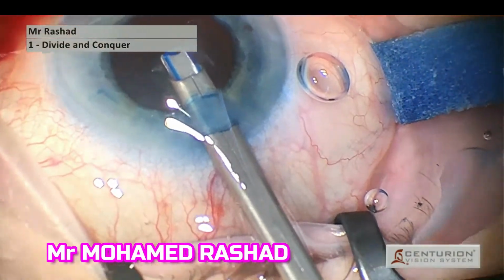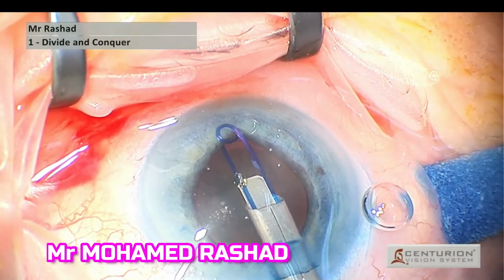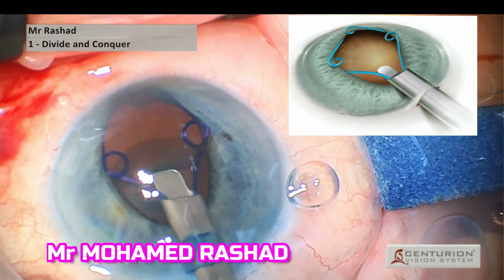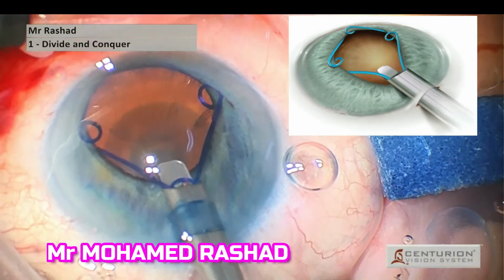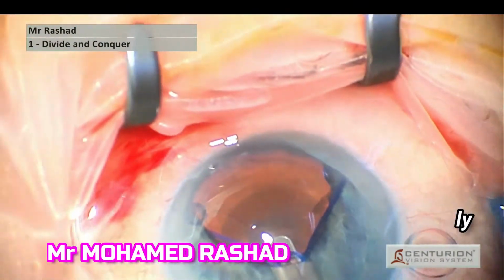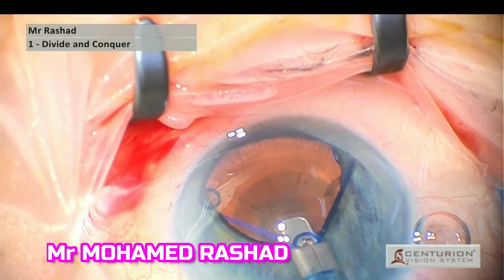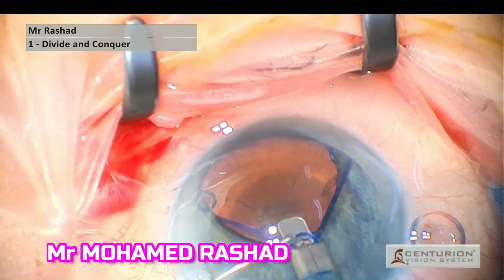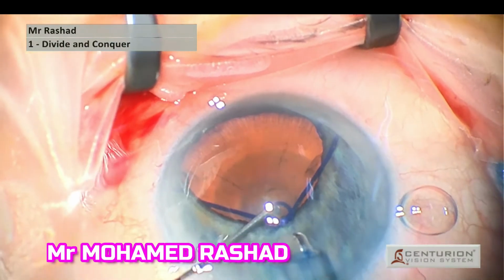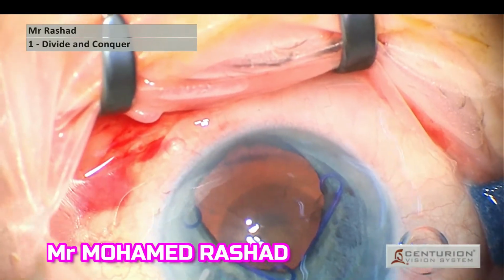And usually I engage the distal scroll in the inferior part of the iris and try to engage the two horizontal scrolls on the edge of the iris as well, as shown here. With the help of the manipulator I pull the proximal scroll and put it on the edge of the iris and engage it as shown here.